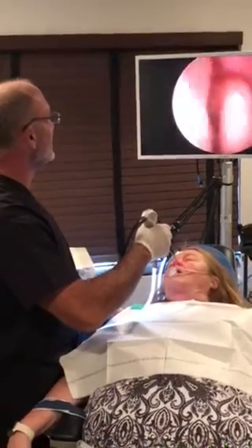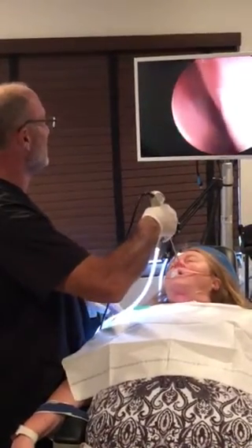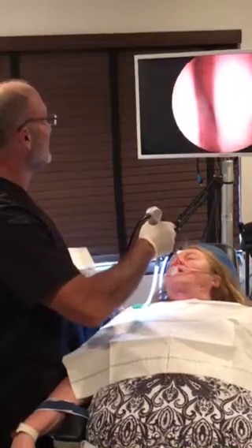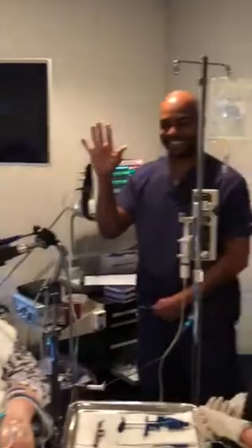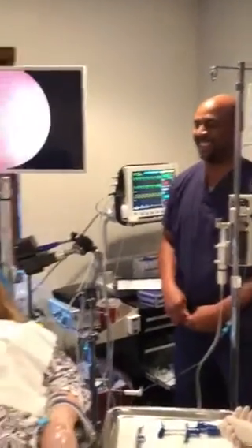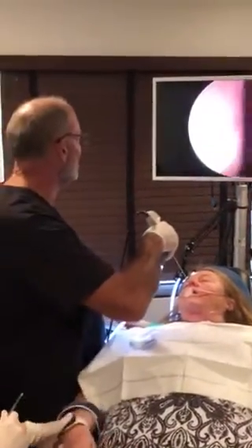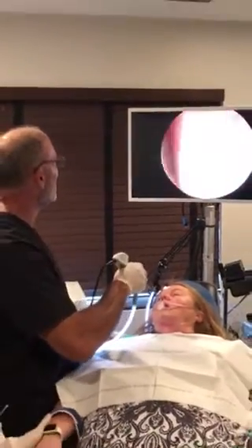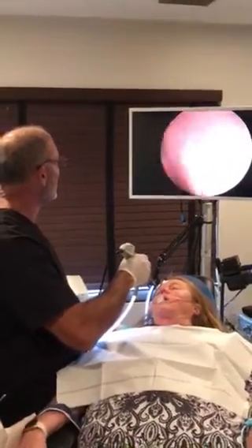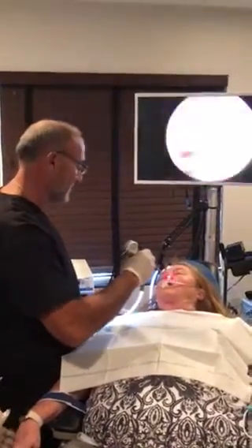Here at Broward Sinus, we're opening up some sinuses with our balloon. Our anesthesia is via Dr. Eberhard, and patients love him. He is their favorite, because we get to do a very thorough job and do exactly what we need to see, and our patients have a very pleasant experience here.